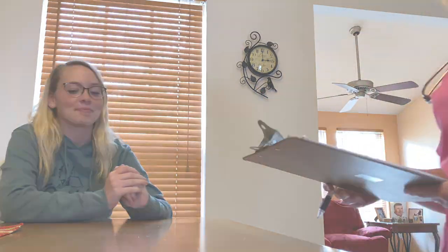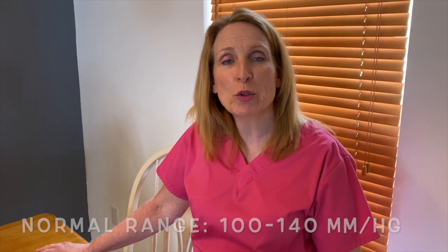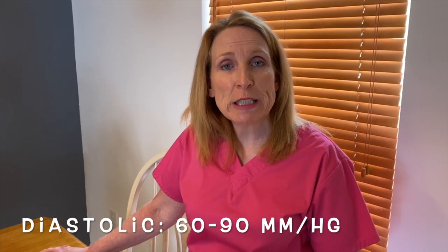Thank you. And just to recap, 124/80 was Sarah's blood pressure. I know that it's normal because the systolic blood pressure should be in the range of 100 to 140 millimeters of mercury. The diastolic should be 60 to 90 millimeters of mercury, so therefore making 124/80 a normal blood pressure.